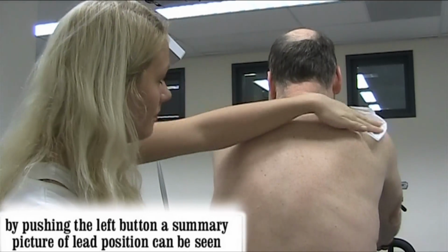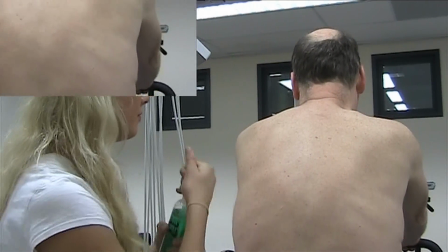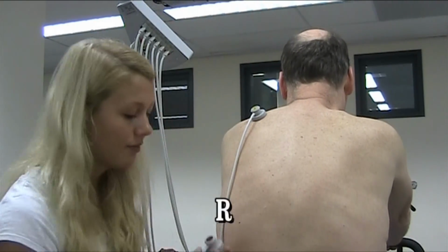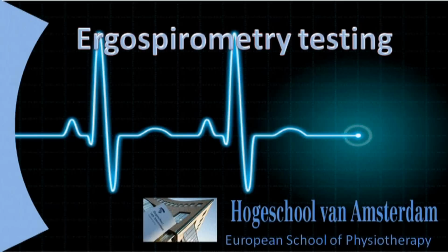The last 4 electrodes are limb leads and are applied at the back side of the body. L is applied on the back of the supraspinatus on the left side. R is applied on the back of the supraspinatus on the right side.